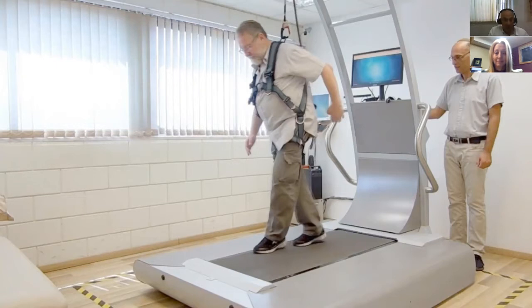We can do this while the client is standing, or we can do this while the client is in gait as well. And that gives us a lot of treatment options to be able to challenge our patients with what we call unexpected perturbation. So we're going to go into what exactly perturbation-based balance training is and how we use the BalanceTutor for this later in our presentation.